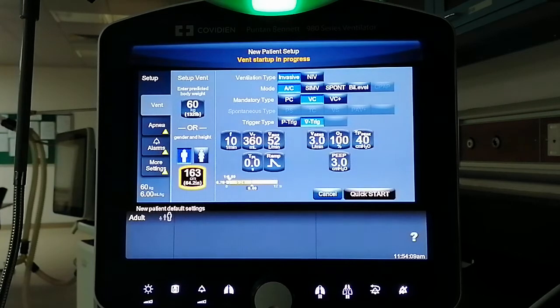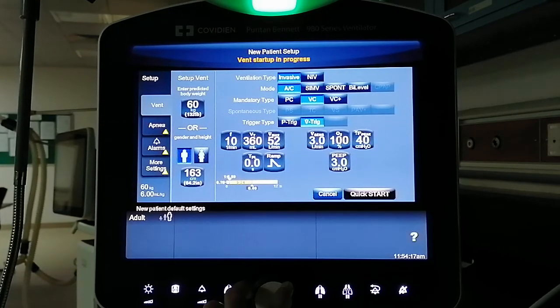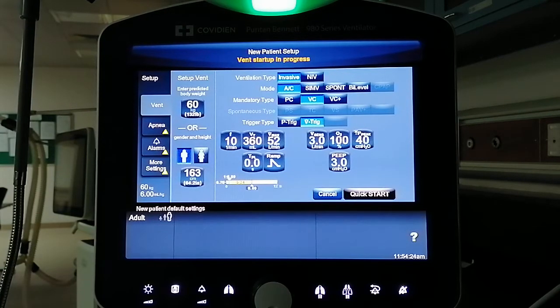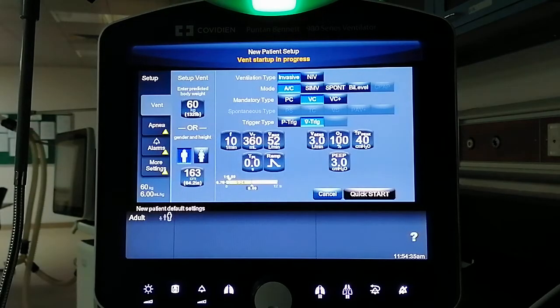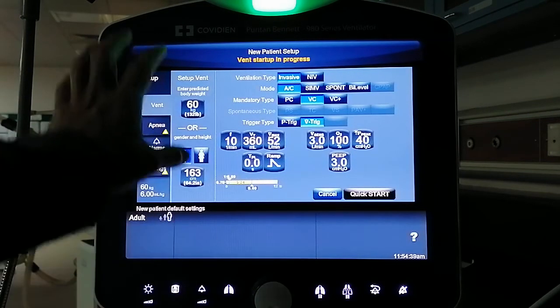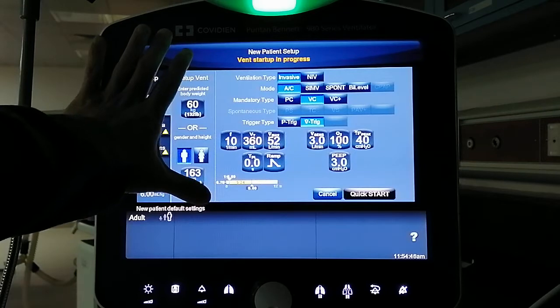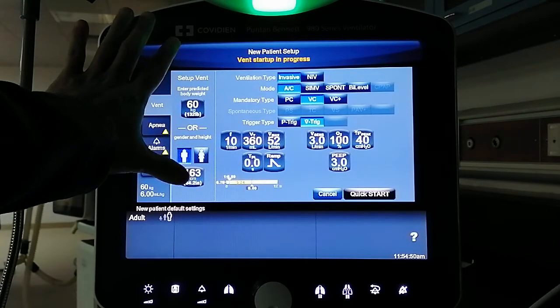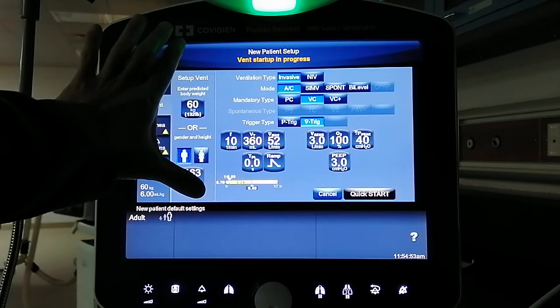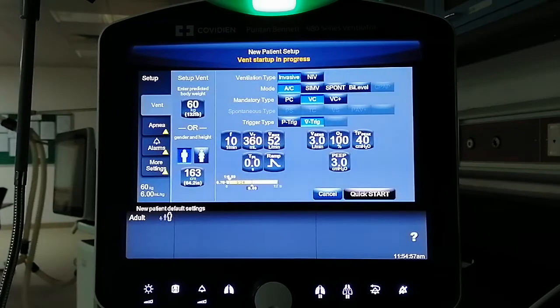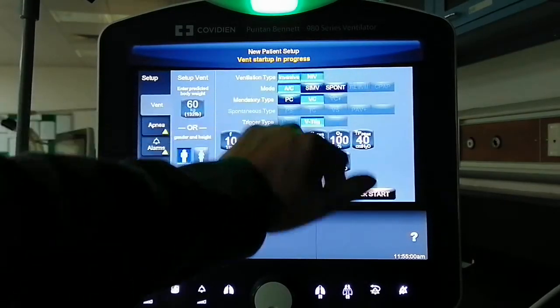Once you have done that, you can see that once you select your new patient, automatically all the necessary data appears on one screen. Under the ventilator setup bin, you have the demographic data for your patient — the gender, the height, and the automatically calculated ideal body weight or predicted body weight. You can then select the ventilation type: invasive or non-invasive.